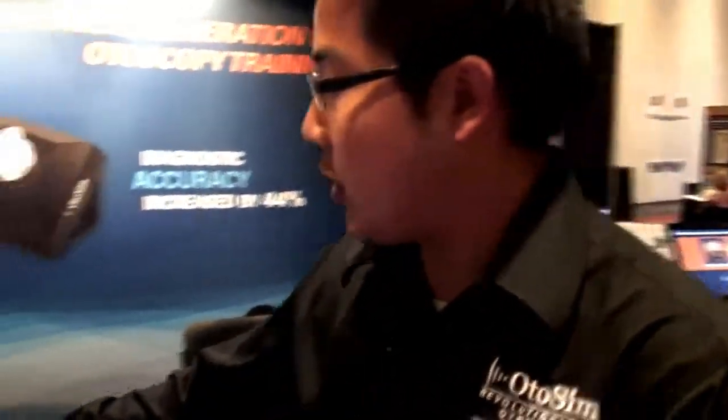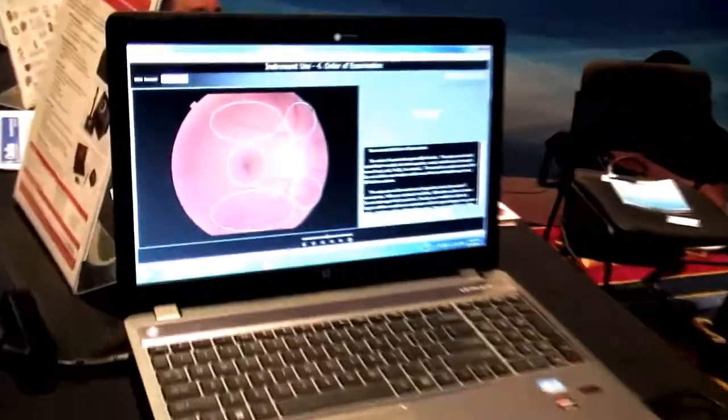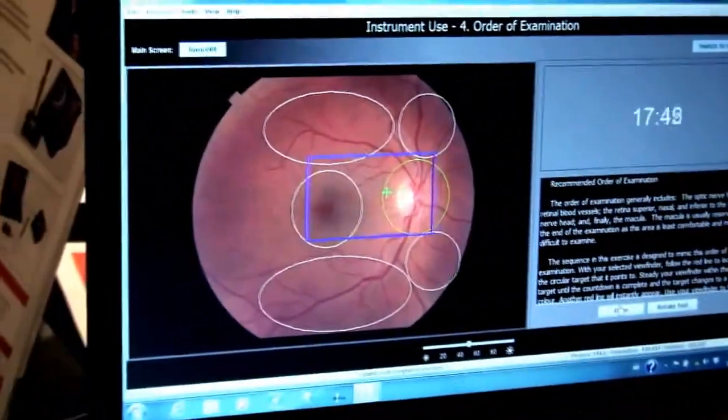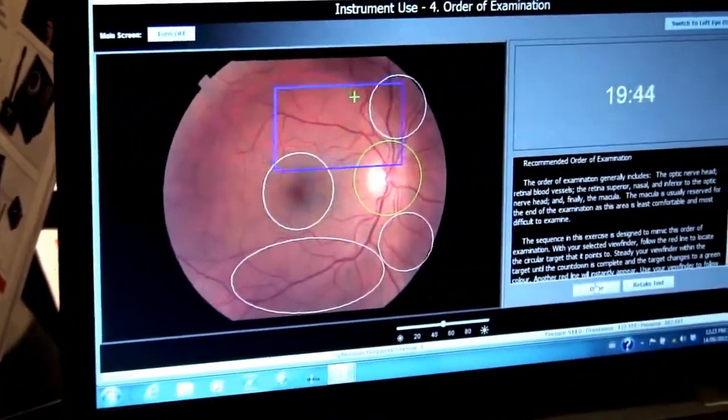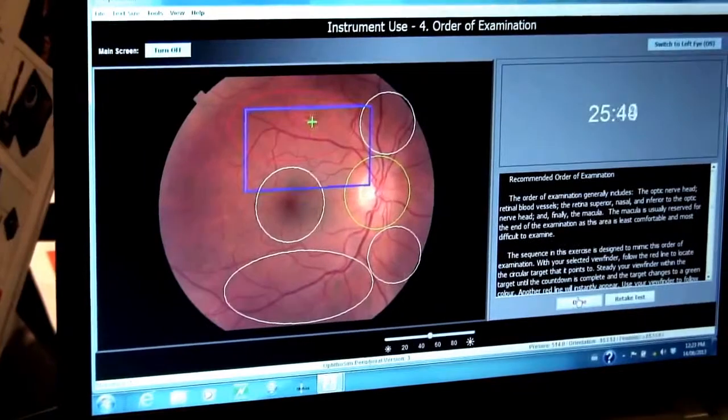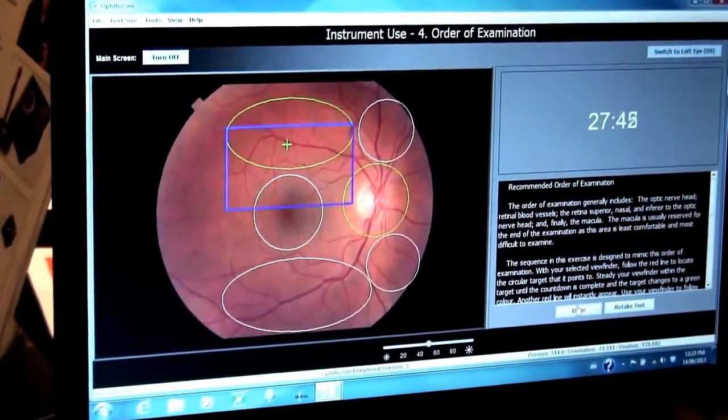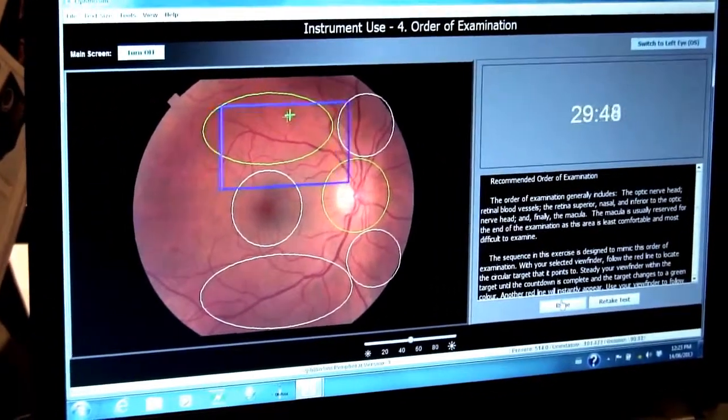For example here, if you look on the screen, we've got these big circles. As a student first starts off with the optic disc and then they'll move up here, which is the proper order to do an eye exam, they're supposed to review this area for a while until it hits green and then they go to the next area.